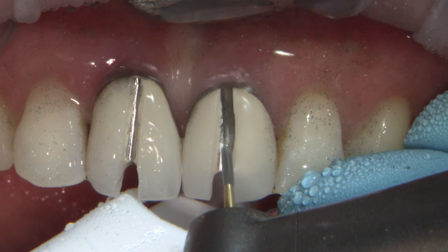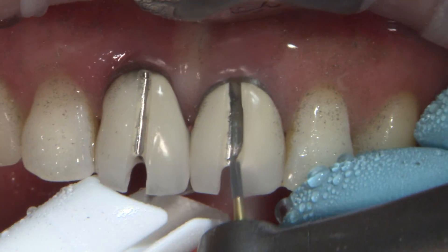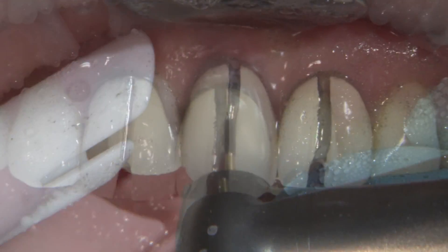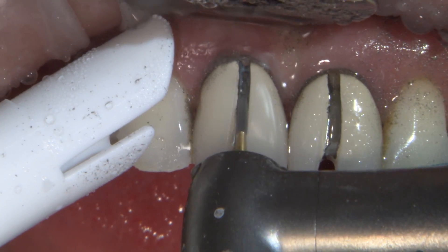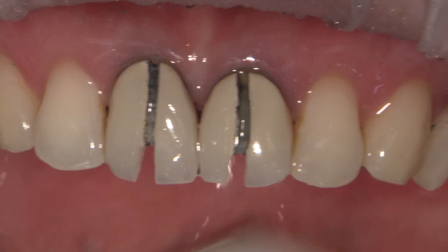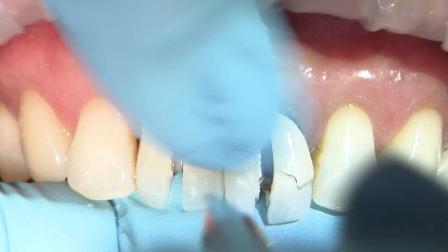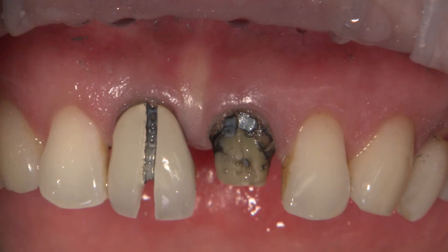Typically I just go straight to a 557 myself, but that's what's kind of cool about dentistry — everyone has their own way to get from A to B. Cutting through the PFMs has actually become one of my favorite things because you can zip through those old crowns since it's a lot more obvious once you make it through the metal and see the tooth structure. You still need to be careful though, because the transitions can come very quickly.